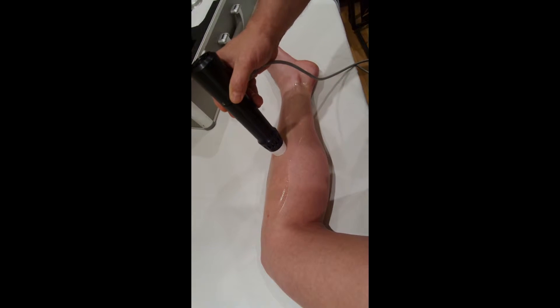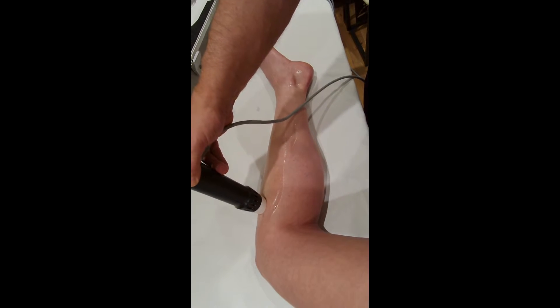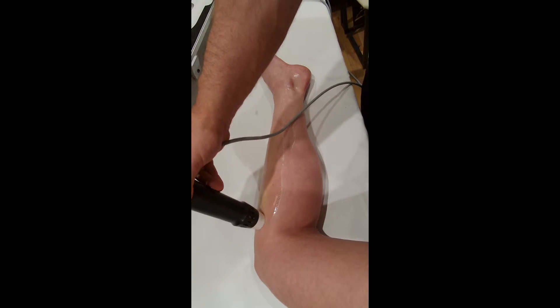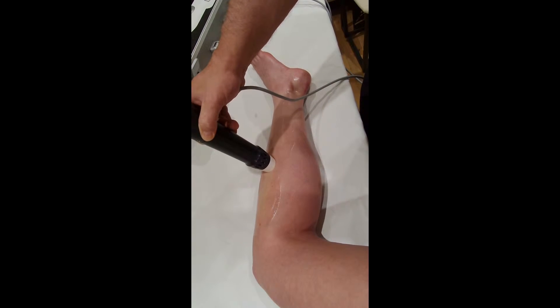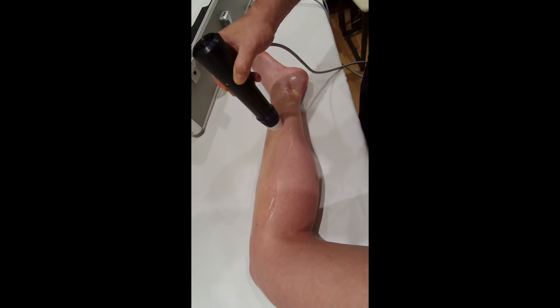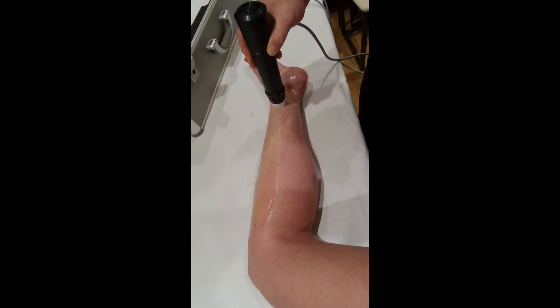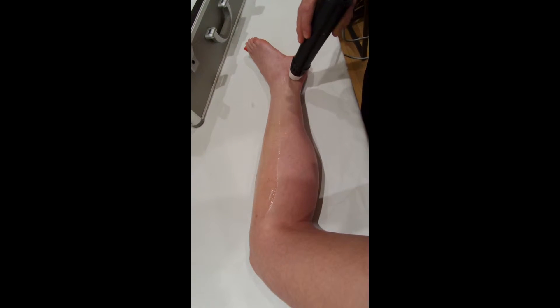I don't like to move the treatment head too quickly. I've seen people move the treatment head extremely quickly, and I've seen people dig the treatment head in. I don't see any real reason to dig the treatment head in — you're going to get the shockwave from the end of the treatment head anyway, and it will pass through and into the patient no matter how hard you're pressing.